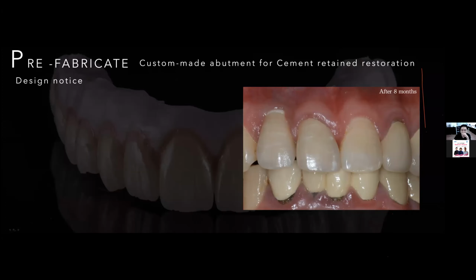But the dentist and the patient say it is nothing, and he doesn't want to remove it, and he doesn't want to use a tissue graft. The patient says it's okay. So we still filed this case, but it never came back.